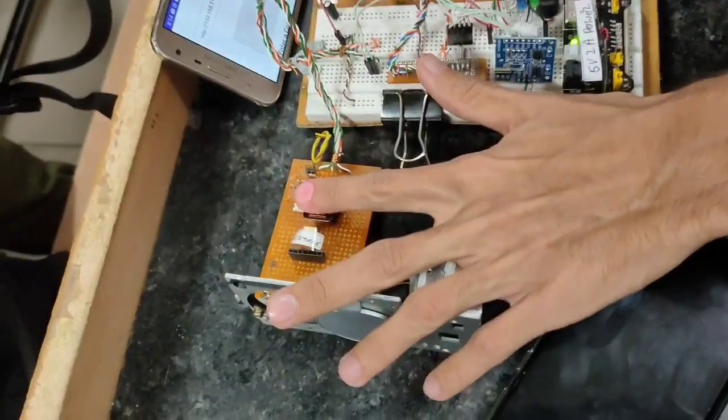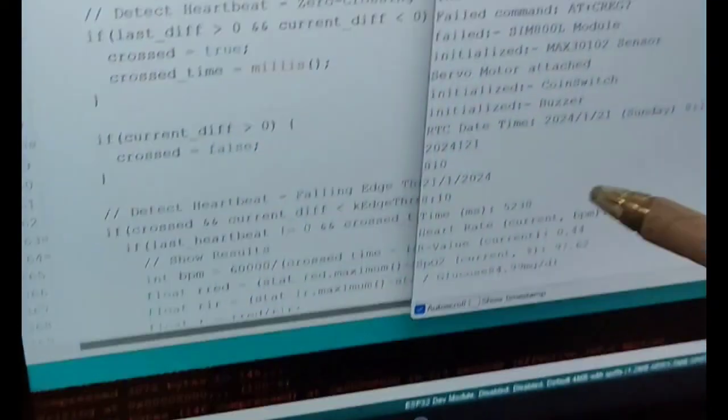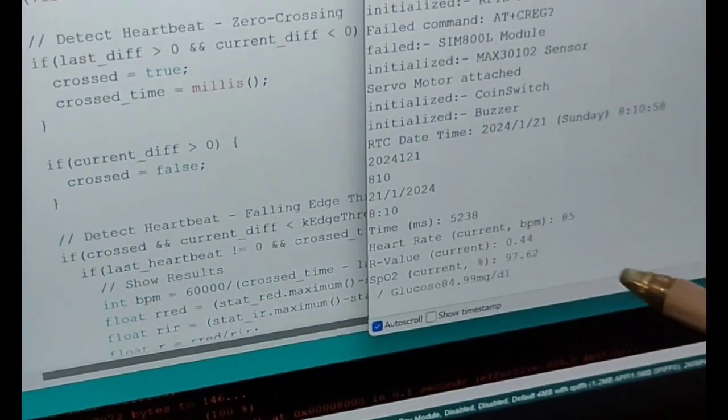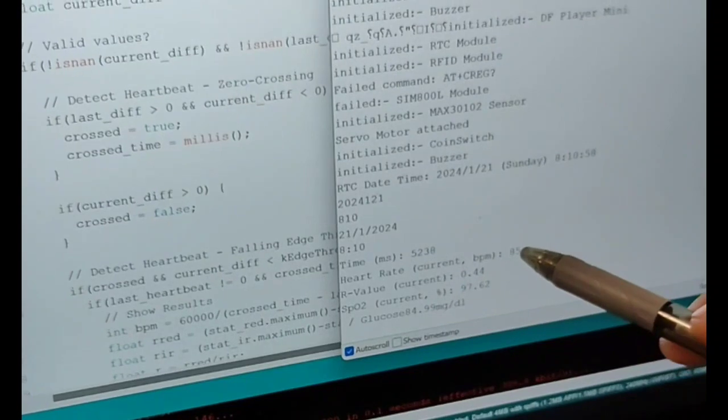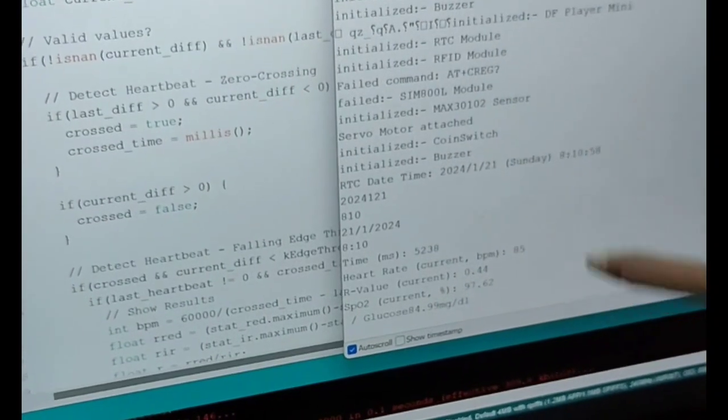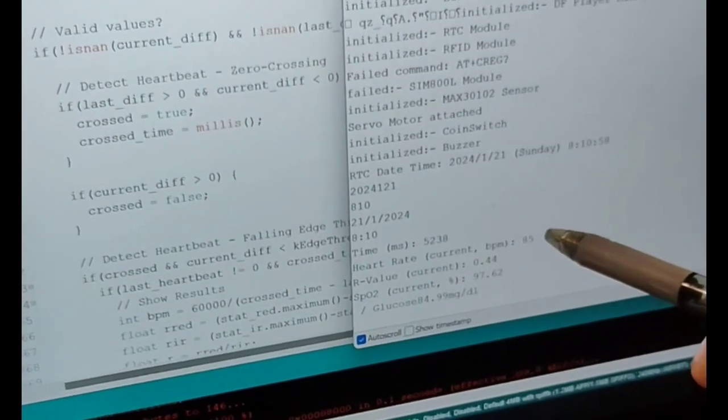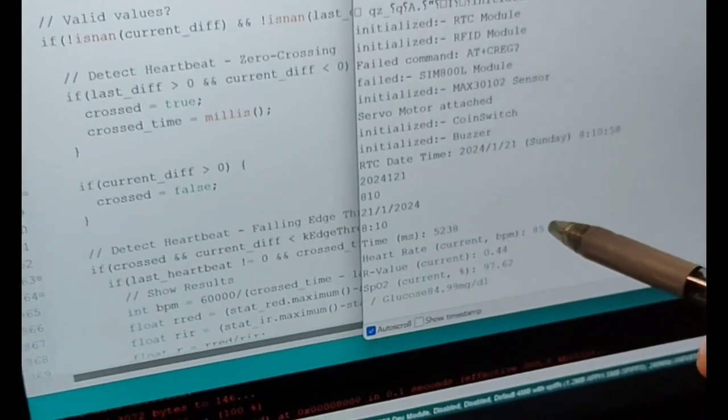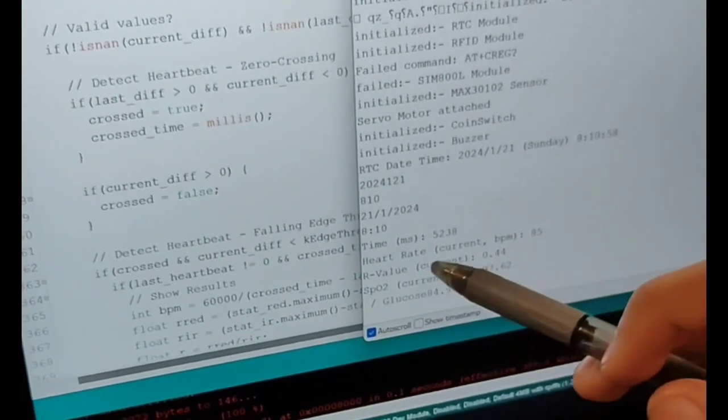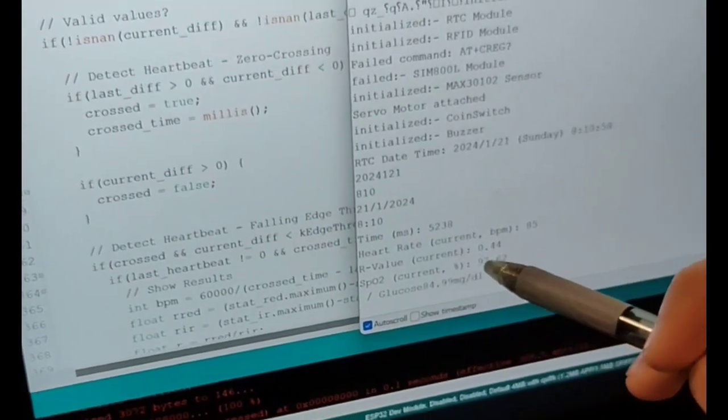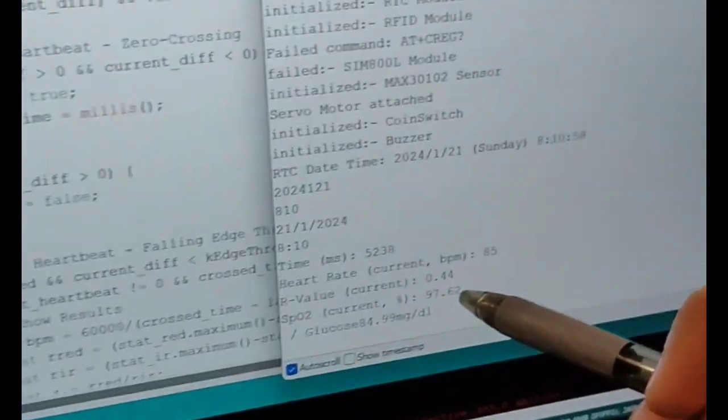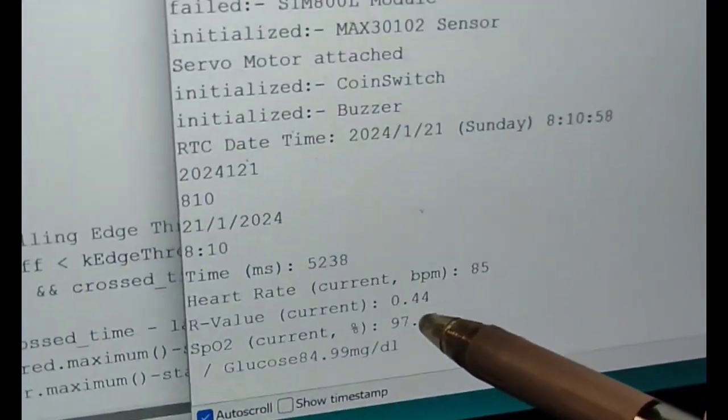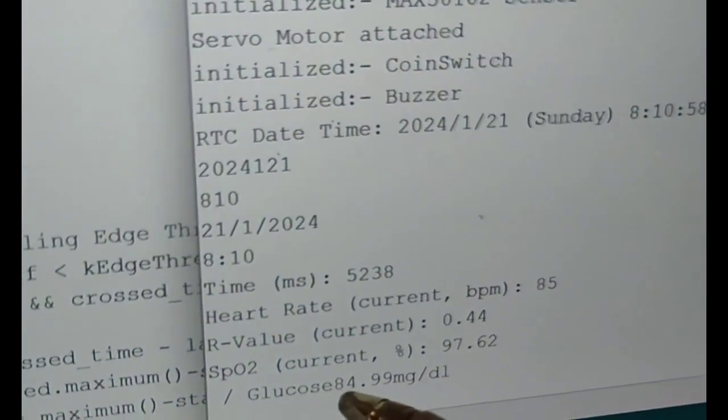Here is the heart rate, which is 85, quite accurate. This is the SPO2, 97.62, quite accurate, and the glucose level.